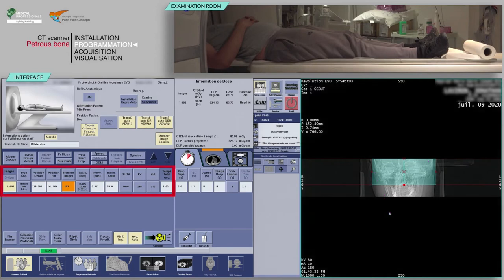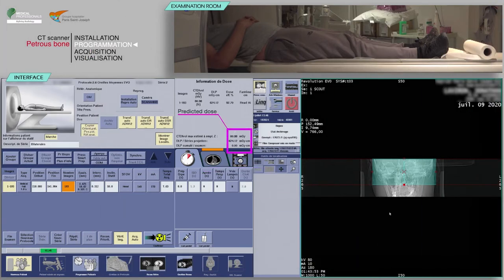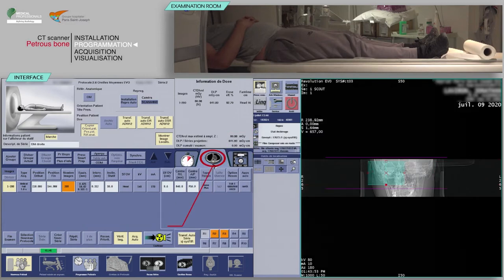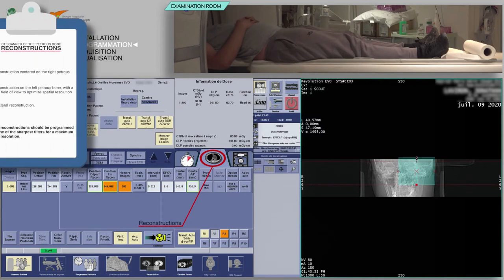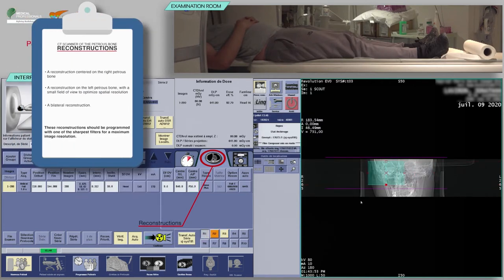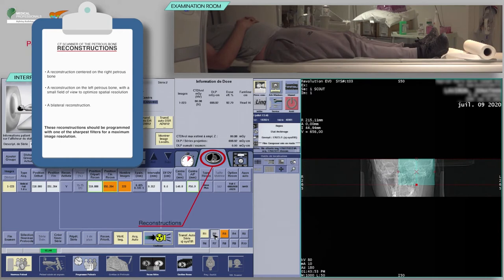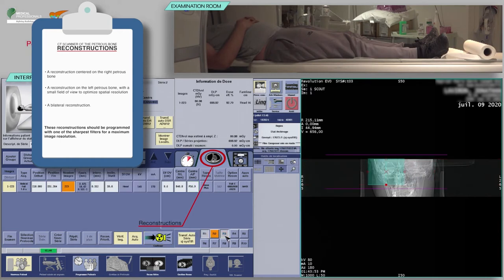Check the consistency of the acquisition parameters, which are often pre-configured. For the acquisition of the petrous bone CT, you will need at least a reconstruction centered on the right petrous bone and another on the left petrous bone, with a small field of view to optimize spatial resolution, and a bilateral reconstruction.